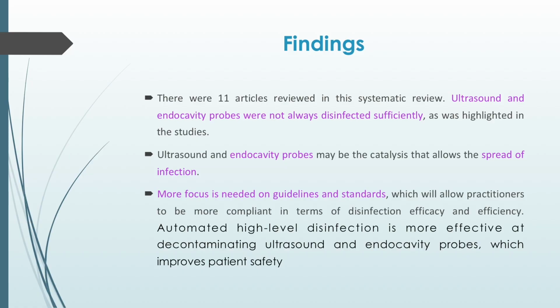So what were the findings? The running theme is that ultrasound probes, if not cleaned and disinfected using automated high-level disinfection, can cause microbial colonization, thus increasing the risk of healthcare-associated infections, with HPV being the most prevalent, along with MRSA. There is a need for ultrasound and endocavity probes to be seen as potential vectors for contamination for our patients. Automated high-level disinfection is more effective at decontaminating ultrasound probes, which improves our patient safety.